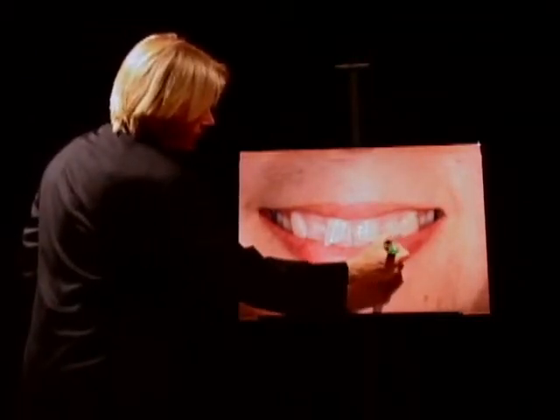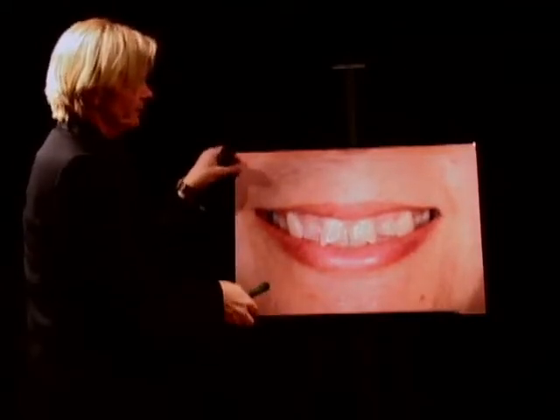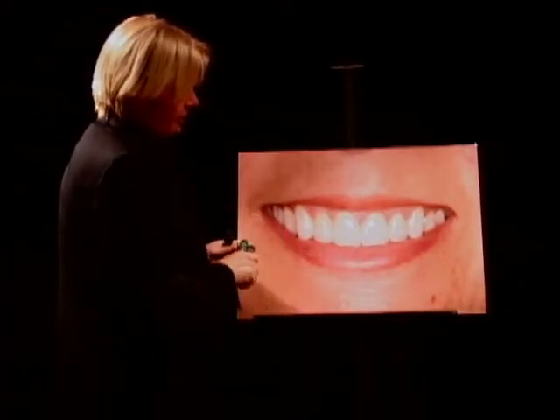So all that had to be developed in many intermediate processes like diagnostic wax-ups, which at one point will be another presentation on YouTube, which are indispensable for complex cases of cosmetic dentistry such as this one. So just keep it short. This is the bottom line basically. And after several steps of treatment, she ended up with this situation. So the bite was slightly opened.